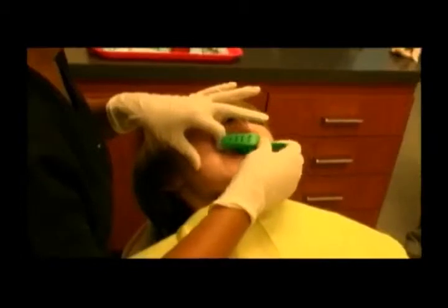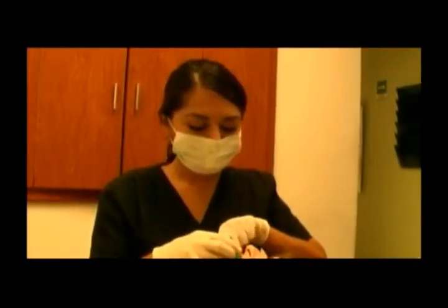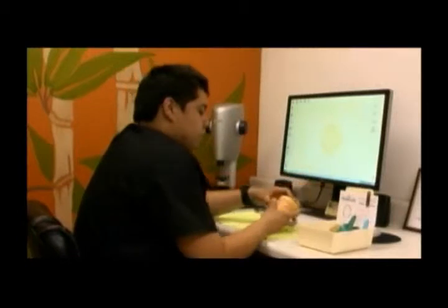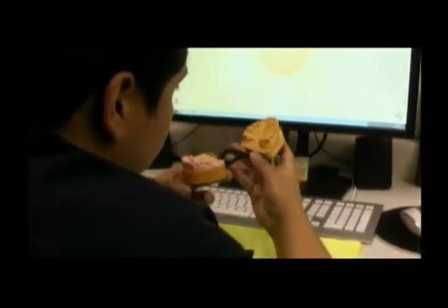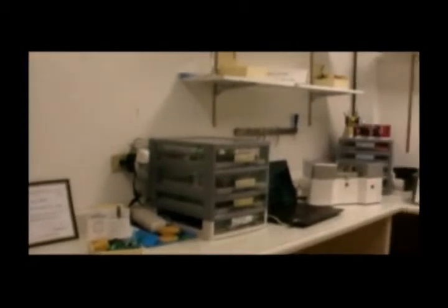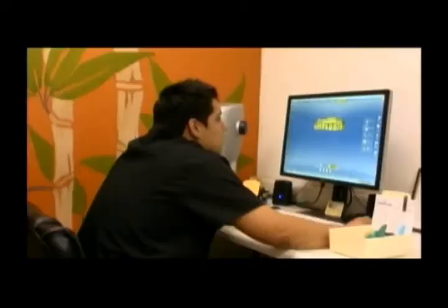As you well know, the usual procedure consists in taking dental impressions or buccal scanning, analyzing the case, making the diagnosis, defining the treatment, and deriving from all this a study, and setup models are made as required. Those can be physical or digital. And based on these, the bracket placement and the wire shape are defined. Here is where you can take advantage of having the Lambda system and Lamdabot incorporated into your operation.